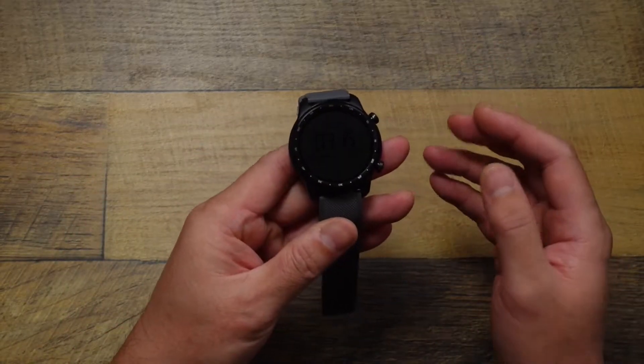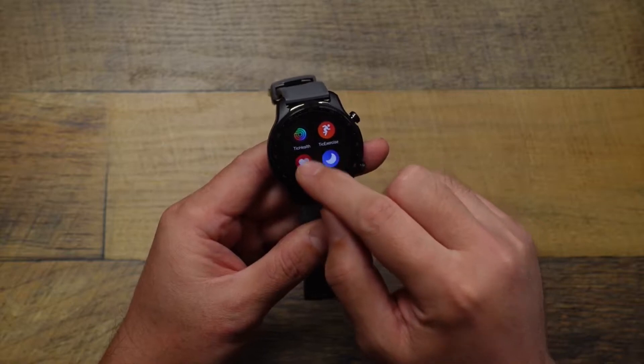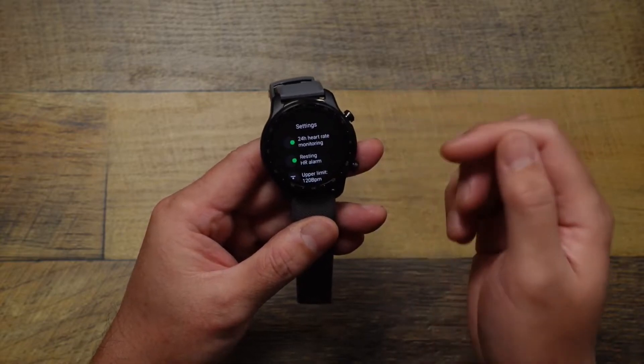A lot of people may not know that, so to actually enable that feature you're gonna have to go into your TicWatch, launch your apps by pressing the button there, go into the TicPulse app, and then scroll to the bottom to the settings and tap that. Then you have 24-hour heart rate monitoring.